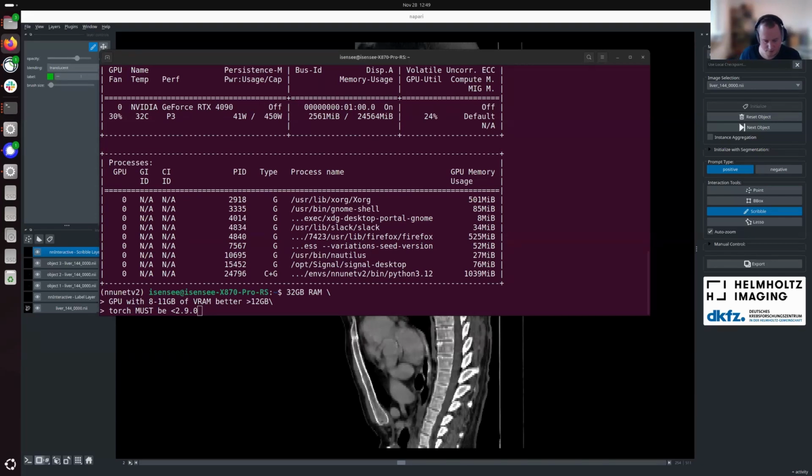So we use these SAM2 generated masks just a small fraction of the time during training. Most of the masks we used were the human generated ones, and then these SAM masks were used, I believe, 10 or 20% of the time. They were, as I mentioned before, intentionally imperfect, so that the model would have to figure out from the prompts what it is that is the correct ground truth here. And this could then, for a given structure, either be a human label or the SAM label. And we think this really helped with generalizability to new objects, because we're not just falling back to known task categories all the time.